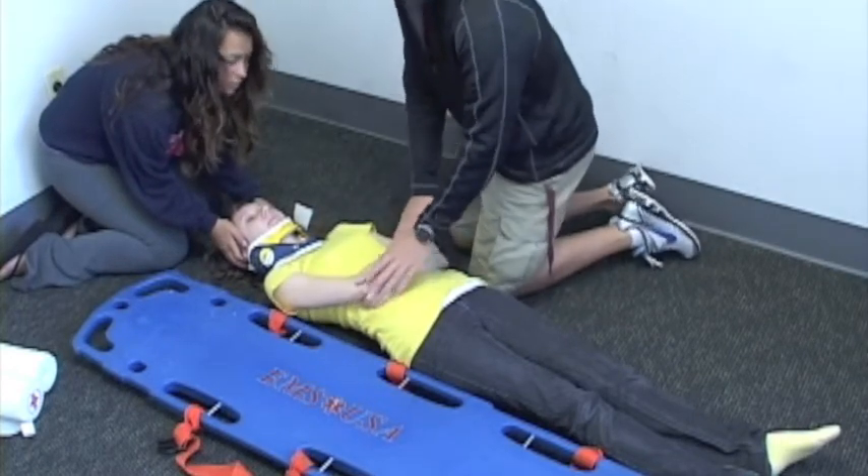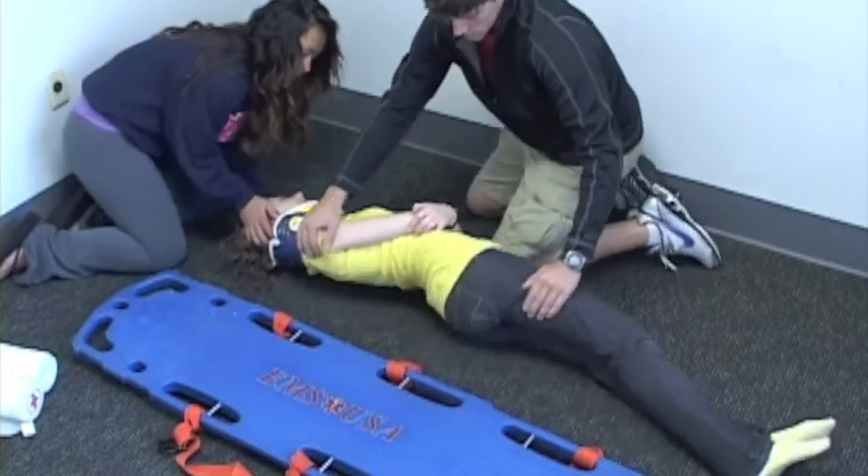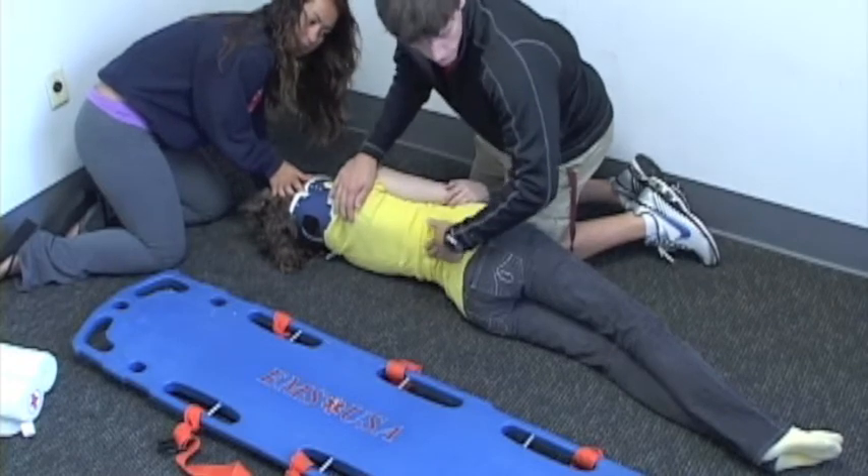On my partner's count, we're going to go ahead and log roll her. On your count. One, two, roll. Check for step-off or bleeding on her back — I don't see any step-off or bleeding.